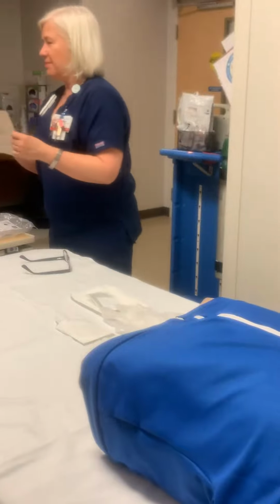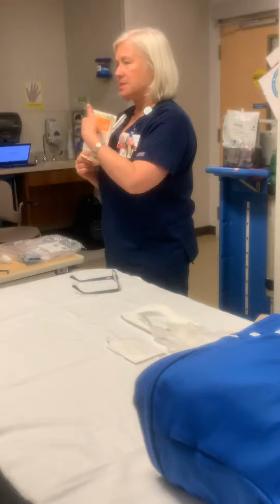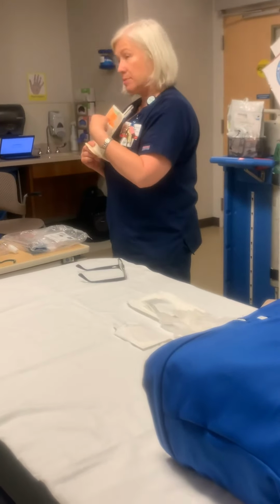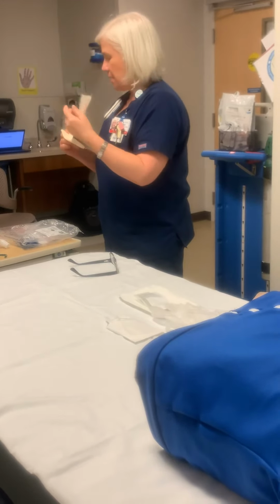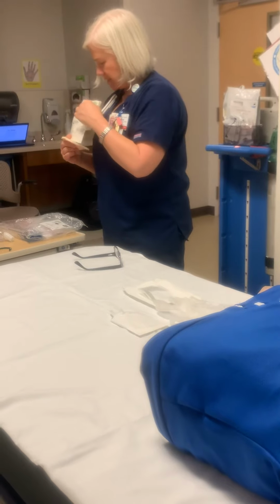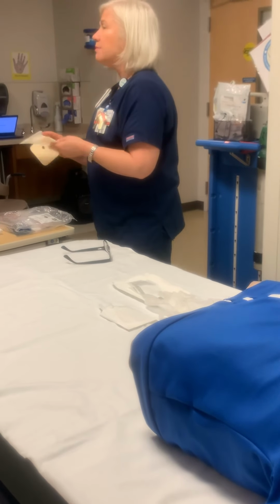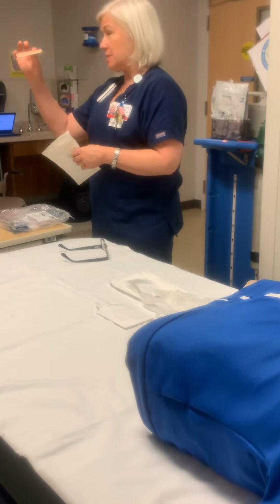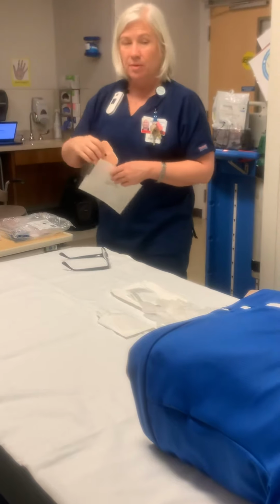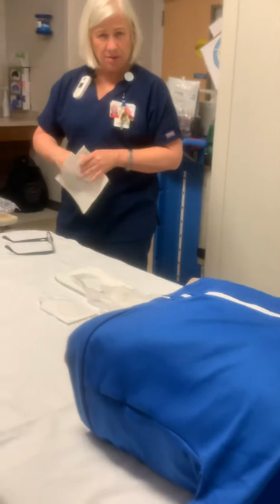I bet they're comfortable. Much more comfortable, and like I said, the company tells you exactly the use right up here: one-time use, obviously. They're sterile, but they don't need to be because the trays aren't sterile. But the other thing is they can stay in for 7 days, mildly absorptive. And the color side goes up? Color side goes up, yeah. But remember, now we're going over trach cleaning here.